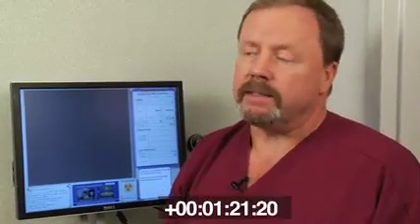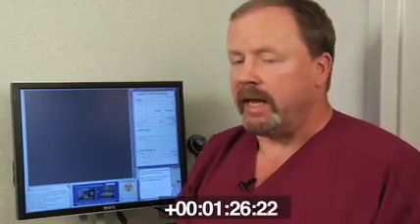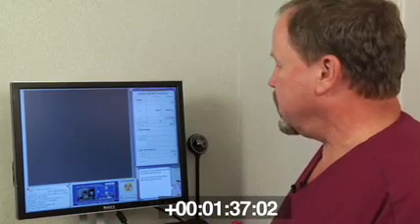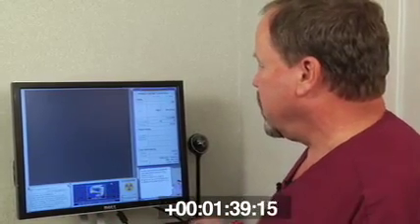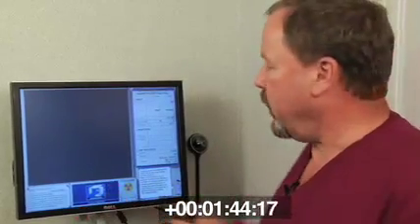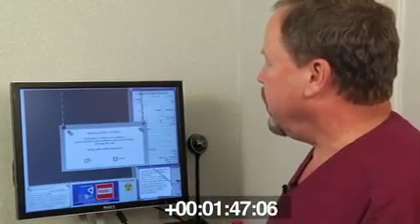And in most all cases, you're probably going to use the wide area with the 512 images. If you have an endo problem, you're going to go with the smaller 5 centimeter screen using either 512 or the 1024 projections. So all we do on this is we click wide area, standard mode, and we go to proceed. So at this point, the program will ask us to initialize the scanner. It's a real quick initialization that makes sure that the x-ray head and tube are all calibrated and ready to go.